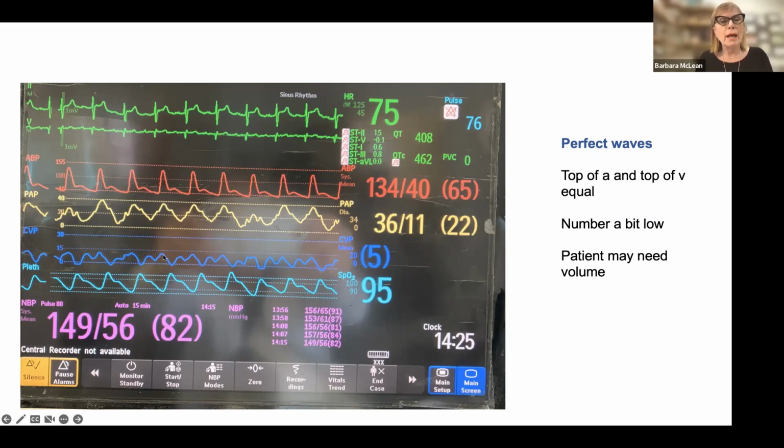And there's my A, and there's my V. There's my A, there's my V. I have to actually do this not on a monitor. I have to be able to lay it down on graphic paper, 2-channel recording, and correlate. But you can see, I said that was the A, but that wasn't the A.